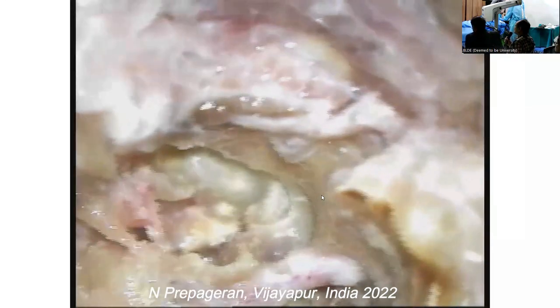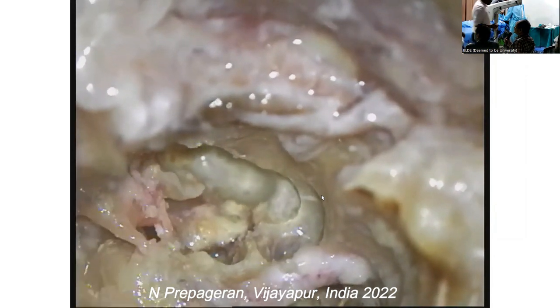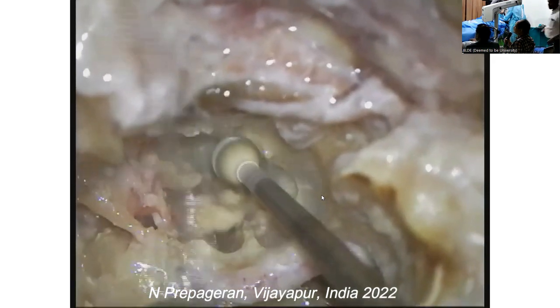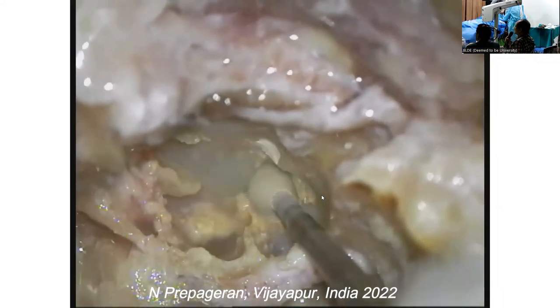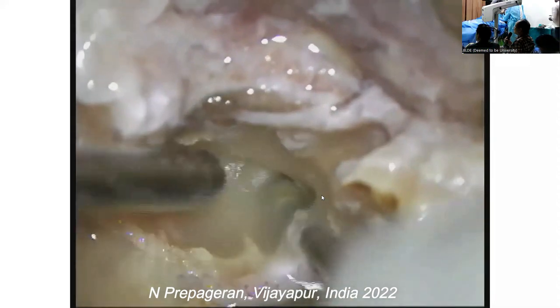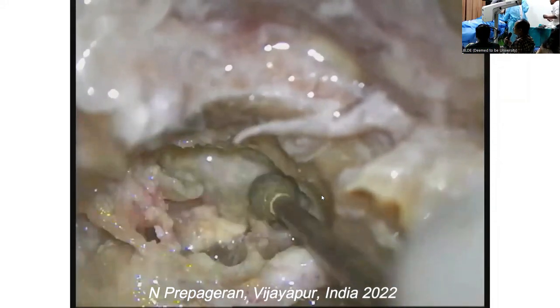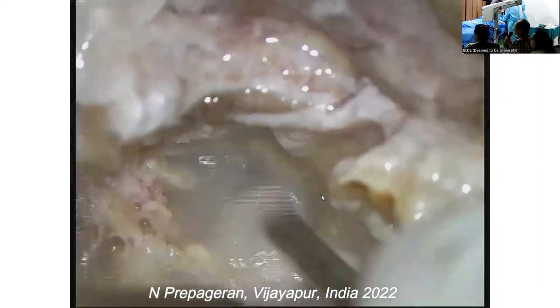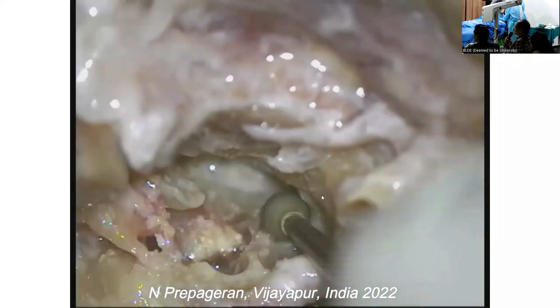So now what I'm trying to do, okay, beautiful, now I can see you clearly. I am trying to find Mr. C. And who is Mr. C? Carotid. Let's see. The carotid and the jugular bulb meet like lovers in the tympanic plate. Beneath this long process of incus will be the incudal bar of bone, which I have to identify.